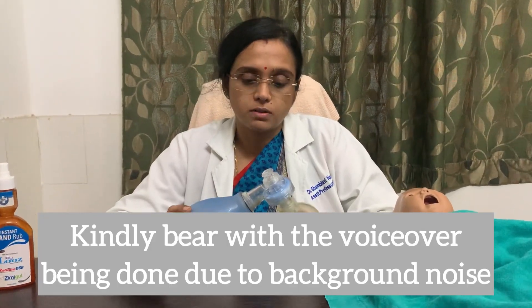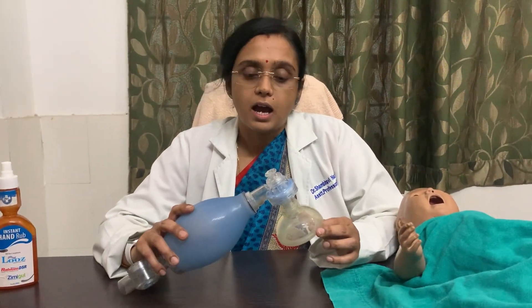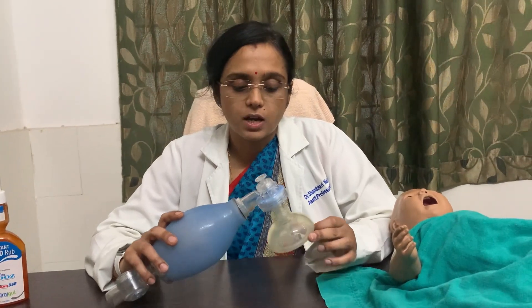Today I will explain what are the indications of using an ambu bag or self-inflating bag and how to use it.